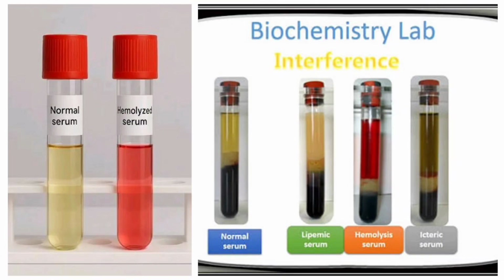You can see this normal serum. Look at the color of this normal serum. Now look at the hemolyzed serum. When you compare these two, you see that that is wrong. In other words, you generated the straight line curve, you generated the linearity using this normal serum. If you now get outside linearity because of hemolyzed serum, the problem is not the analyzer. The problem now is the sample. I have my reason for explaining that.